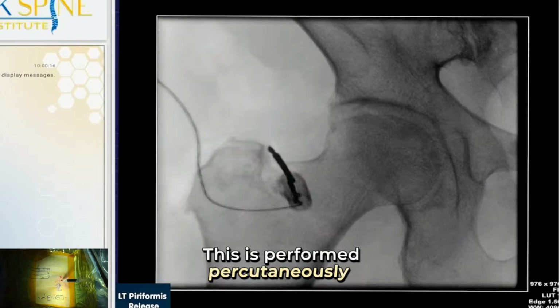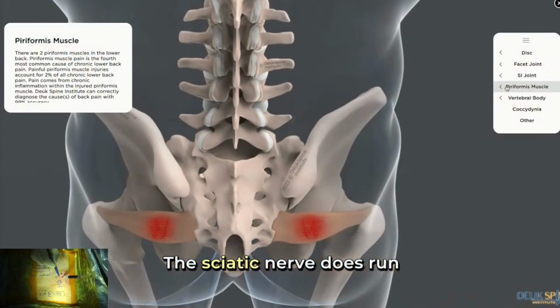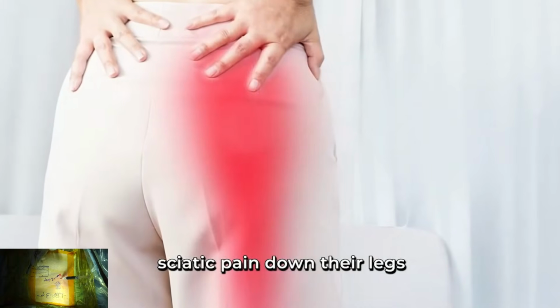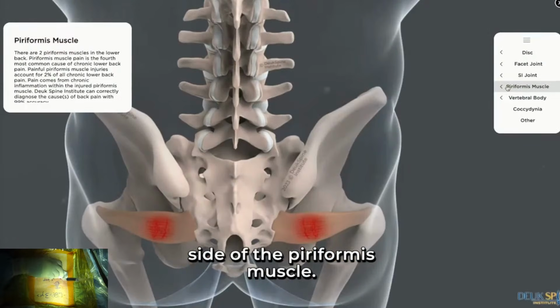This is performed percutaneously with a 4mm incision. The sciatic nerve does run through the piriformis muscle, and many patients with piriformis muscle syndrome also have sciatic pain down their legs, with pain, numbness, tingling, and weakness in the leg that's affected on the side of the piriformis muscle.